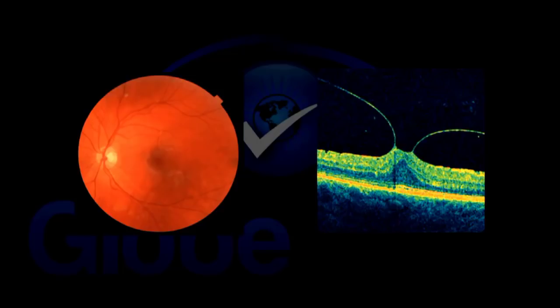Not a good candidate for a multifocal lens. The last thing we want to do is put a multifocal lens in this patient, and then afterwards try to explain why they're not seeing well. So lots of pathology we're missing just looking at the fundus, taking a photograph.